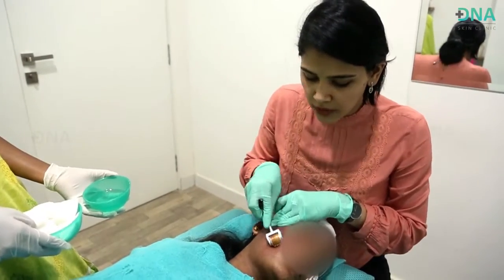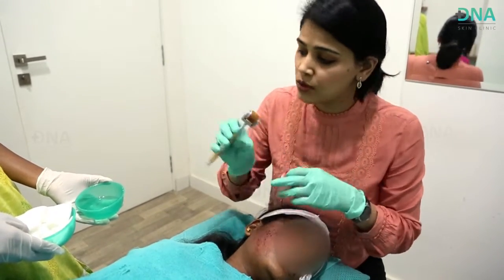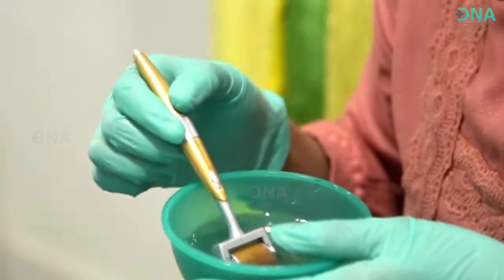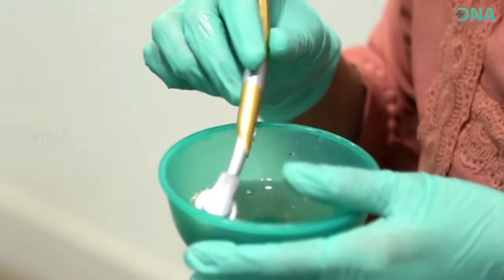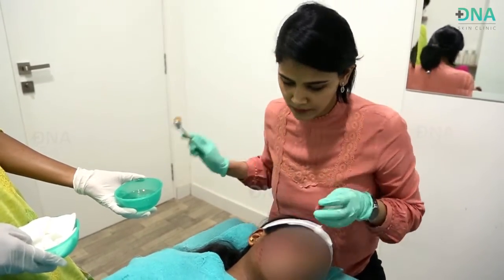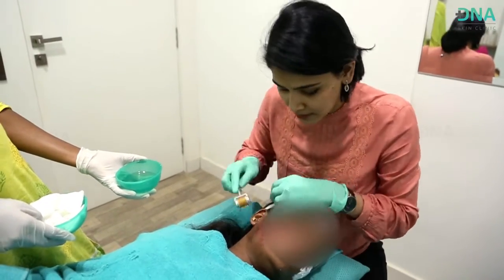After rolling the roller a couple of times, if you see, the blood can get stuck to the roller. So I usually prefer cleaning it with normal saline so that the blood doesn't get clotted. After the procedure, if you want to clean it once and for all, it becomes really difficult because the blood can get clotted onto the roller. So this will keep my roller really clean.